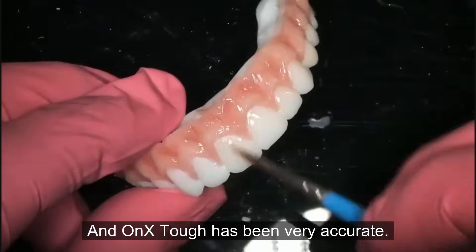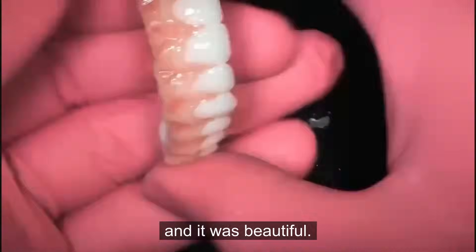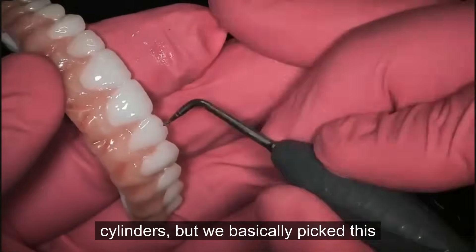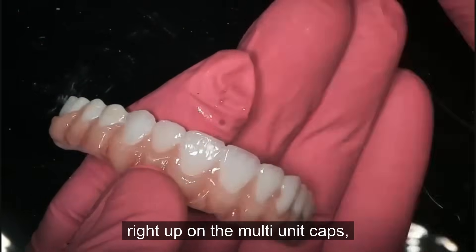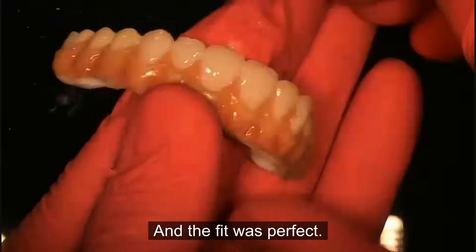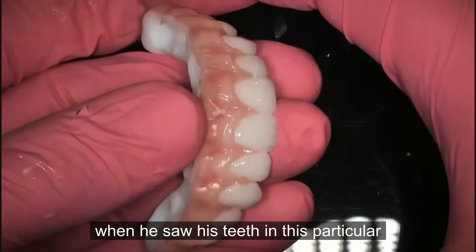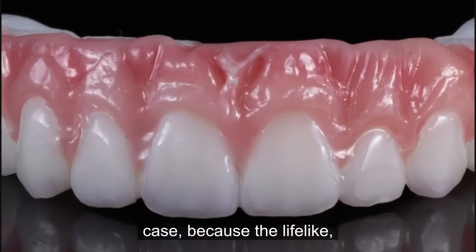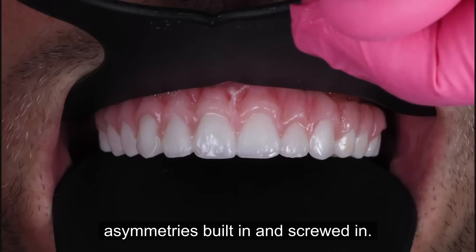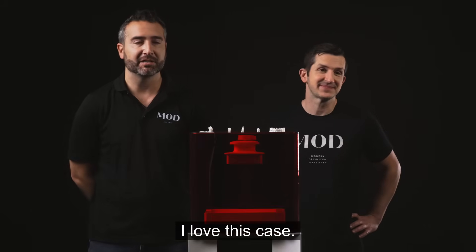OnX Tough has been very accurate — zero adjustments on this case, and it was beautiful. We basically picked this right up on the multi-unit caps, the P caps that come with this system, and the fit was perfect. I remember the patient almost tearing up when he saw his teeth because he wanted it to be lifelike, which is why we had some little asymmetries built in. It was screwed in, and for the first time this patient had teeth fixed in his mouth. It was incredible.